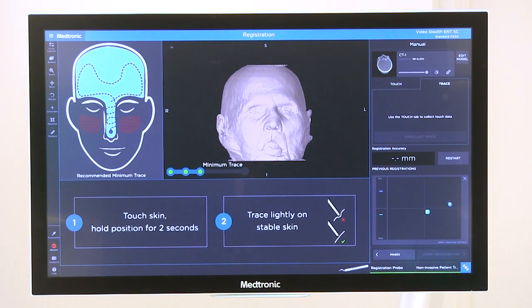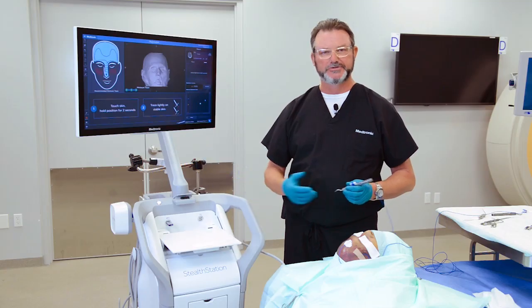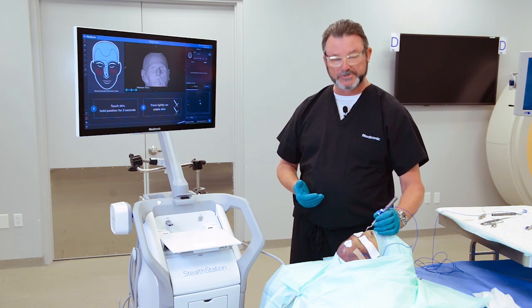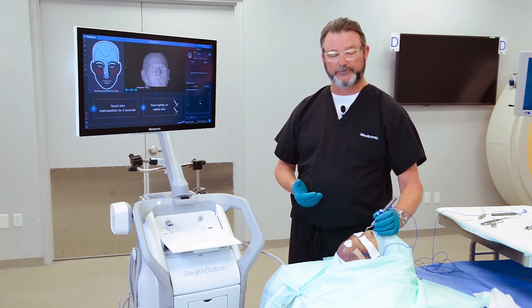Now what the system has done is created up, down, left, and right, so it understands where that is now. The next thing you'll do is perform a trace.